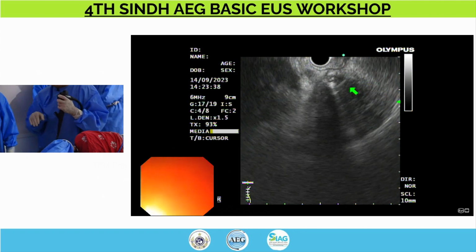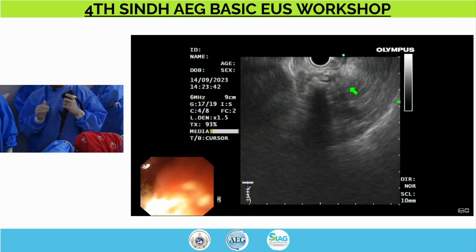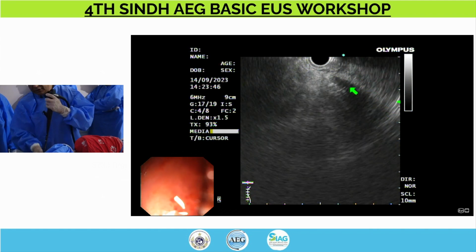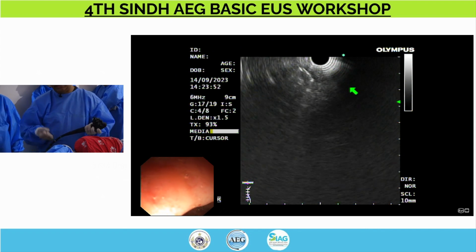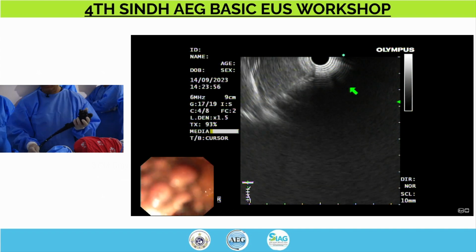Other thing, if you look at it, I'm controlling my scope mostly with my left hand and with my shoulders. My right hand is free. If the scope is torqued like this with the right hand, my hand is not free. I can't do it, and it's an unstable scope position. So that's what you want to avoid.